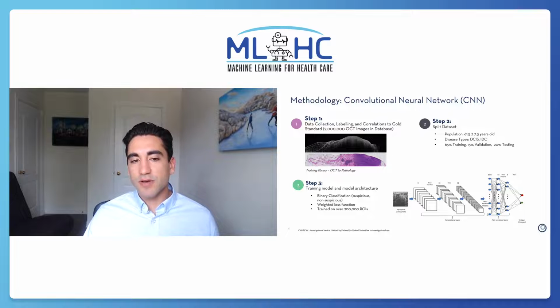learning. We have developed a convolutional neural network algorithm that performs binary classification of wide-field OCT images into suspicious and non-suspicious classes. We use image data which was collected, analyzed, labeled, and validated with a high concordance to permanent pathology by subject matter experts and clinicians.